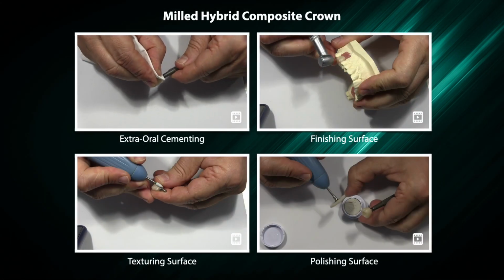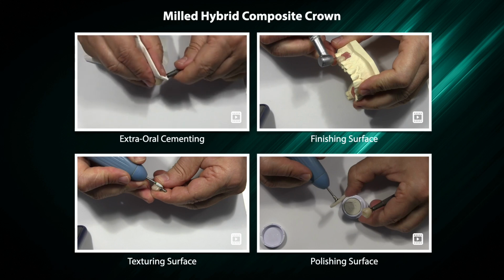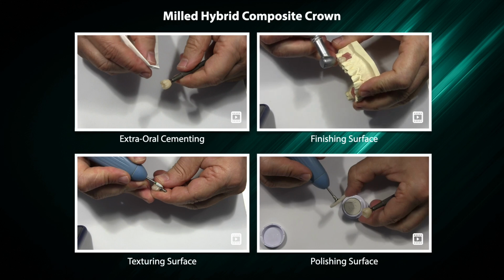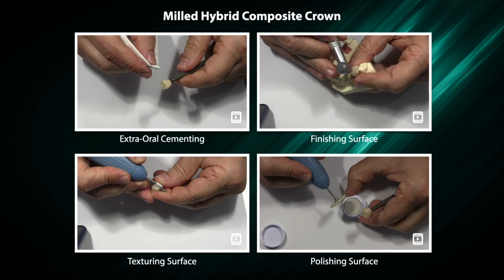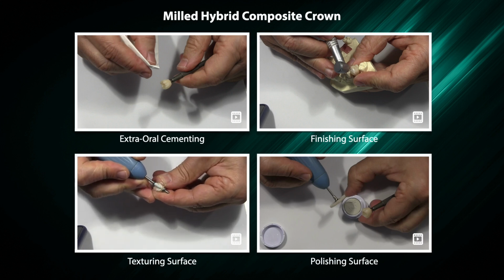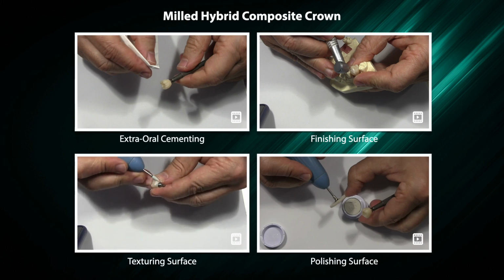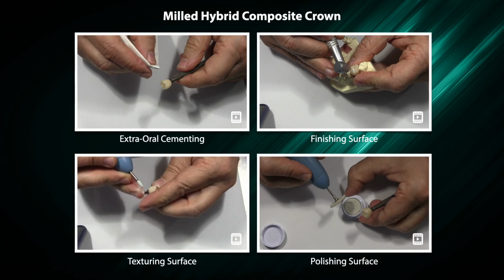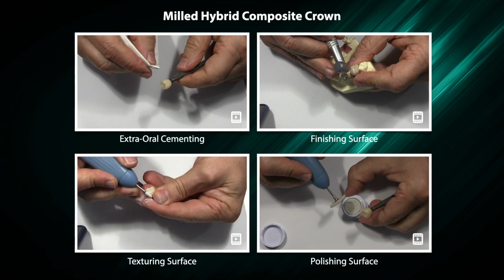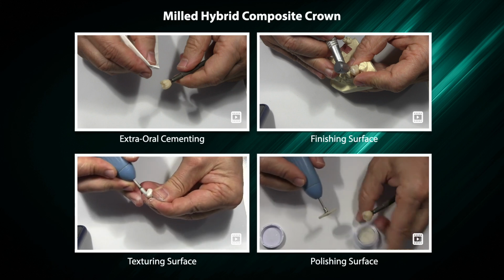Extraoral cementing. Finishing surface. Texturing surface. Polishing surface.